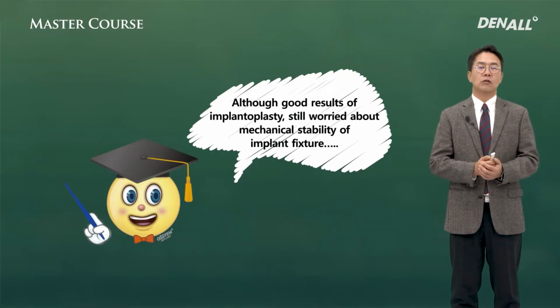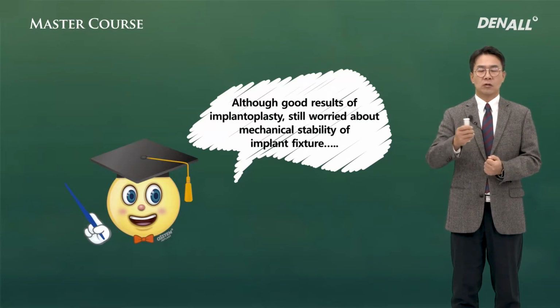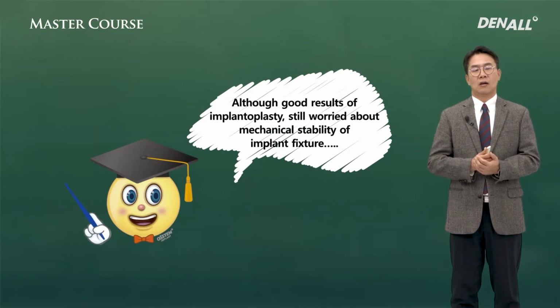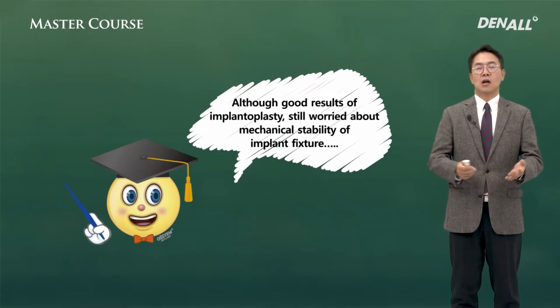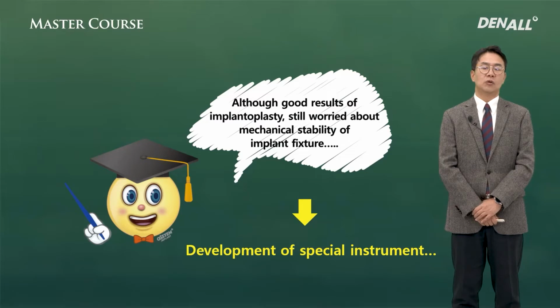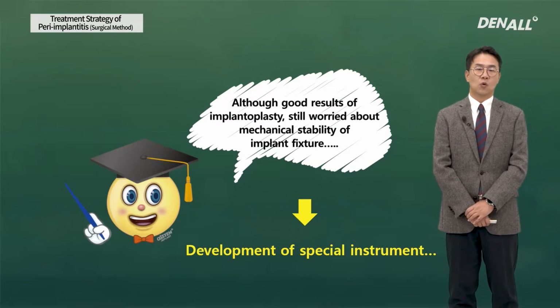There are many positive findings, however, as you grind off the implant surface, some may be concerned that the thickness may be reduced excessively. There are many tools available so that even if you grind it, you can maintain the form. It's a good idea to use these.